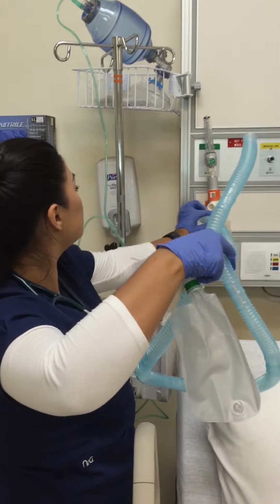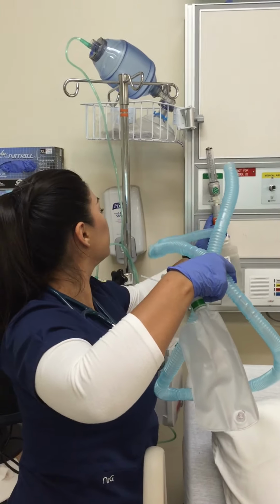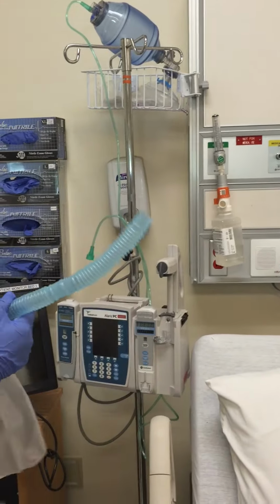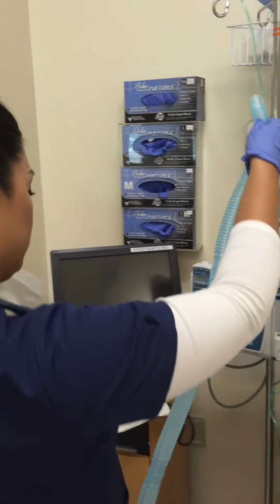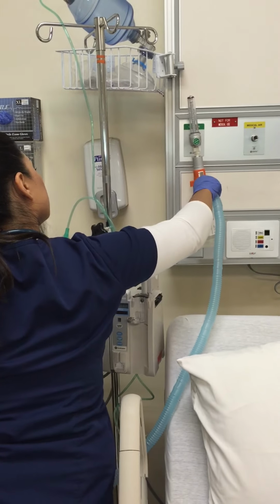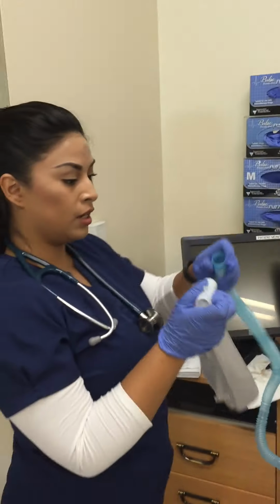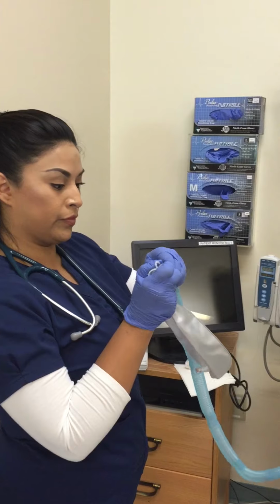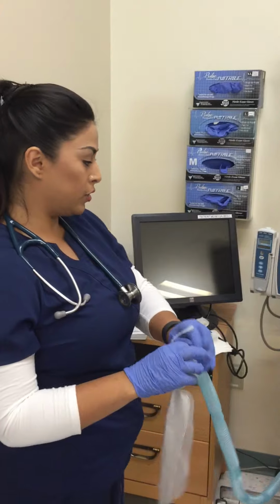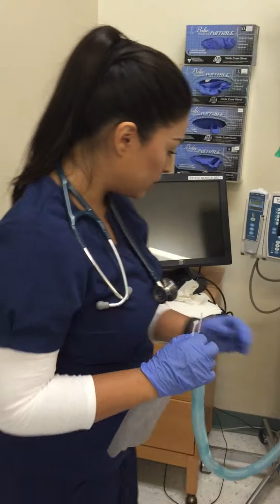It's probably better to attach this. So that should be tight enough, and I can connect it to my water trap. You want the water trap at the bottom of the bed so that the condensation can collect in here. So I'm going to raise the bed just a little bit.